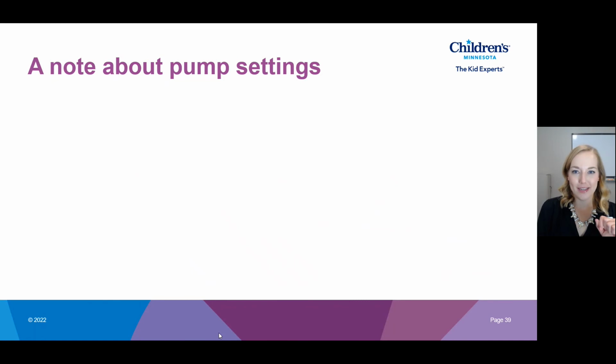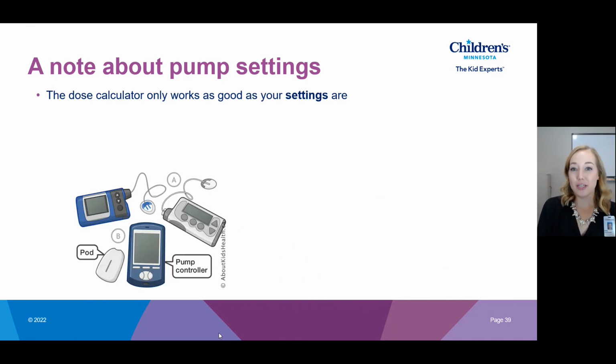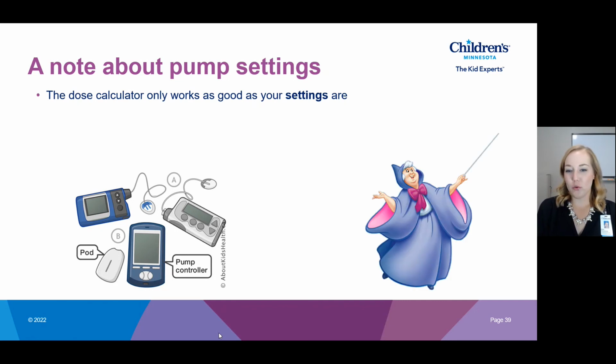Okay, a note about our pump settings. The dose calculator is only going to work as good as your settings are. And what that means is we need to be fine-tuning our doses frequently. If we don't update them, then the bolus calculator isn't going to work because we're not using what our body currently needs. So a lot of times when we start insulin pump therapy or we're thinking about it, we think that the pump is going to be our fairy godmother and just make diabetes so easy, and it totally takes it away. And I'm sorry to tell you, but that's not true.